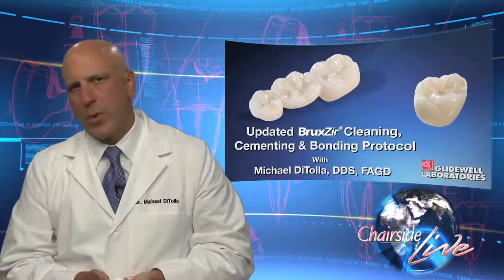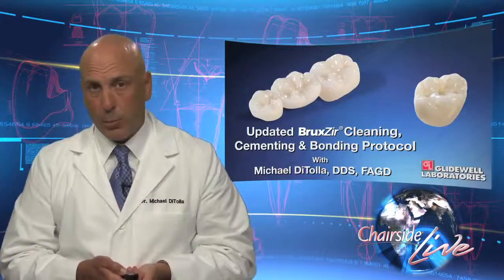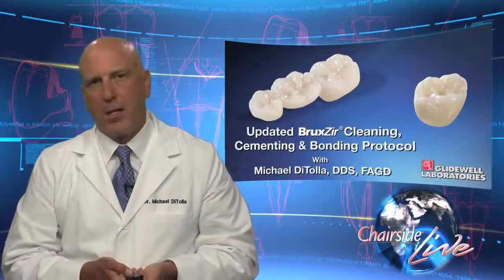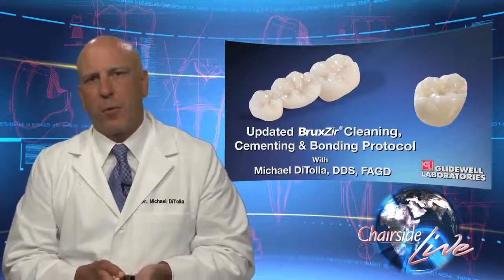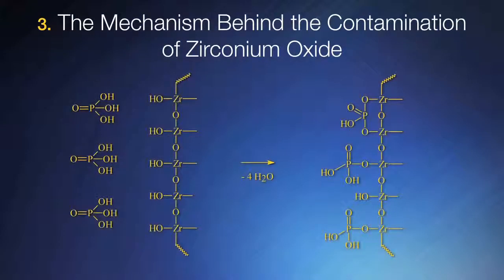So what actually happens when the phosphate groups in the saliva come in contact with the zirconium oxide in the BruxZir crown? Well, it's an acid-base reaction. If you remember back to your high school chemistry, when an acid and a base come together, you get formation of a salt and water. As you see here on the screen, when the phosphate groups on the left react with the zirconium oxide, the salt we get is zirconium phosphate, and we lose some water in that reaction as well. And so now all the binding sites are taken up by these phosphate groups on the zirconia.